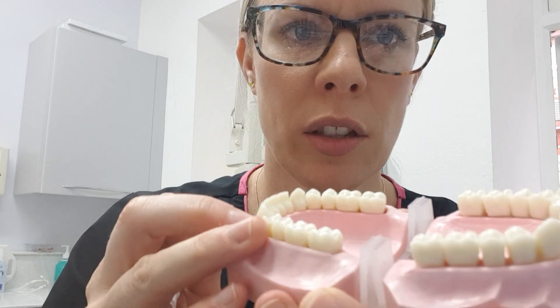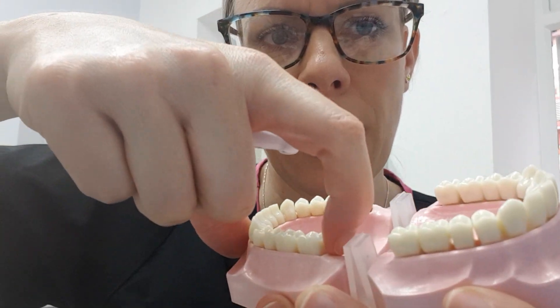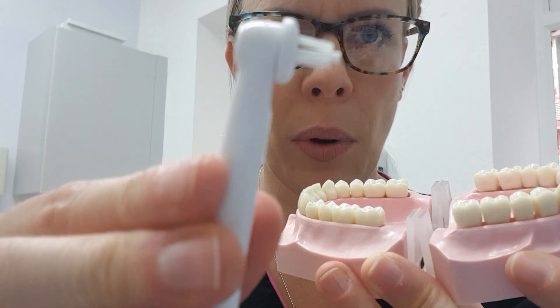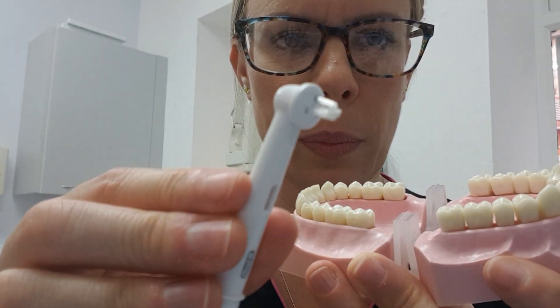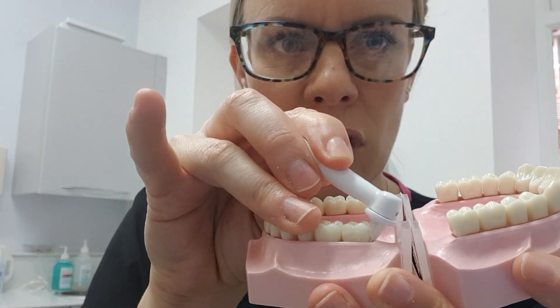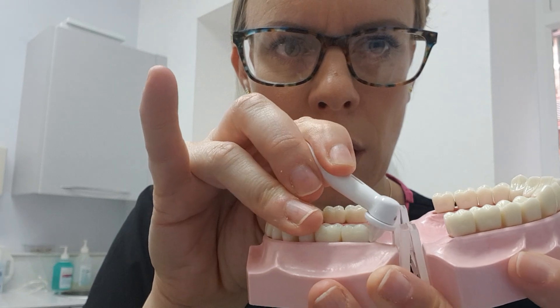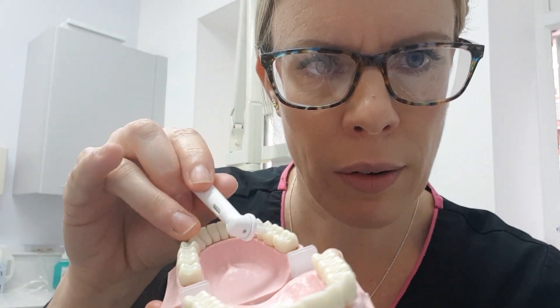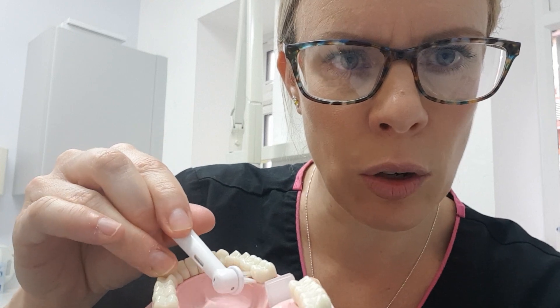The times to use these little brushes are around wisdom teeth. I'm just going to get out a tooth model. I had a wisdom tooth extracted a couple of years ago and it left a little crater where I can't get my toothbrush around. So I pop this onto my Oral-B toothbrush after I've cleaned with my normal head and just work the bristles around the back of the tooth. You can also work them under the tongue, which is where a lot of people struggle to reach.